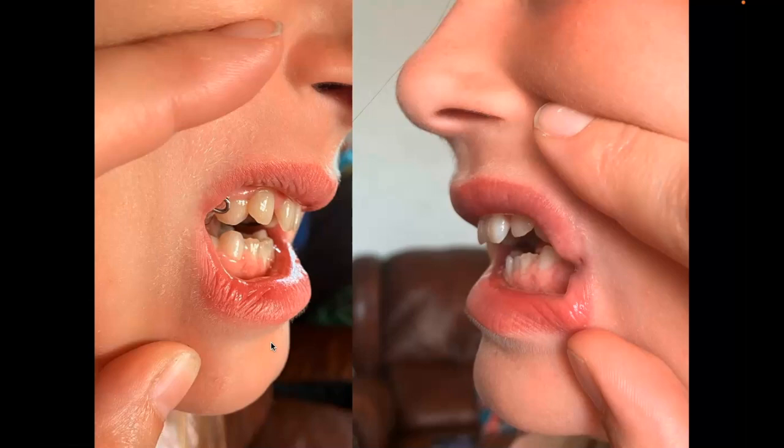If we're not seeing any more changes and we're not continuing to make progress, one of two things has happened. Either A, they're burnt out, or B, we've hit our max as far as what they're going to move with this set of treatment, and so we'll stop from there. You can see as we expand, those teeth are going to come down a little bit. You can see already some changes in the facial structure. She had this on for 7 months total.